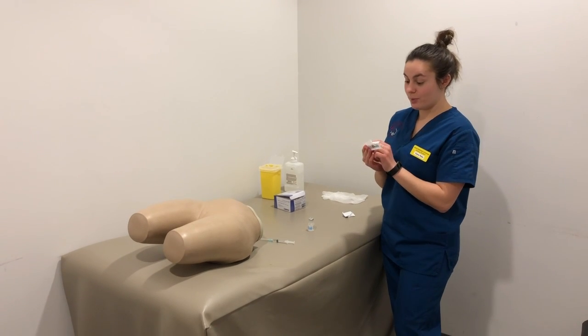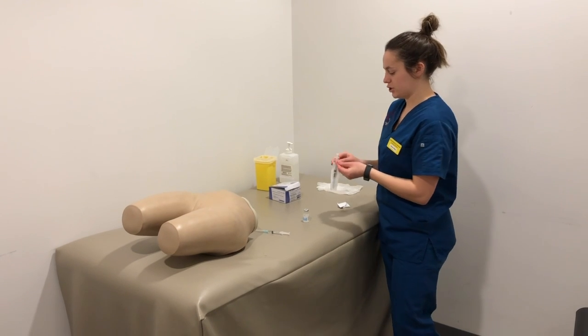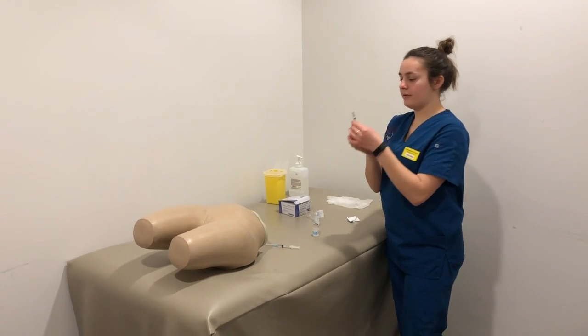And next I'm going to open up the needle, which is again my 22 gauge for my intramuscular injection. So again, I will draw back.